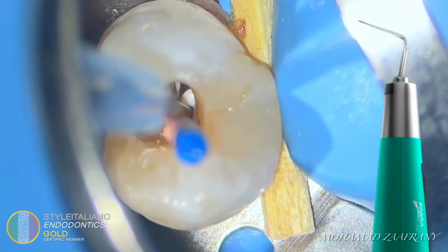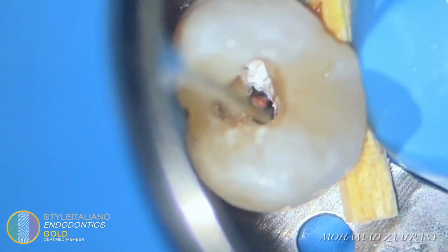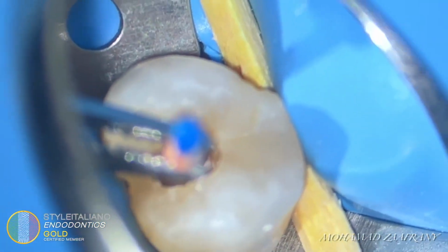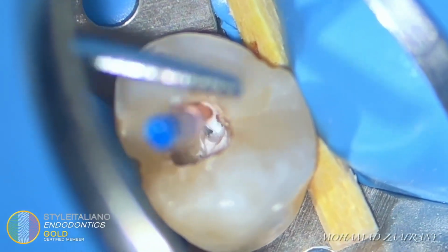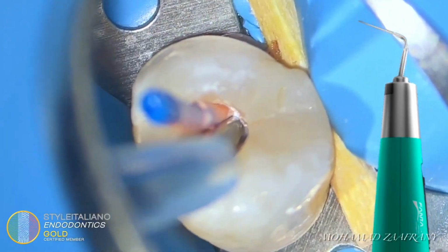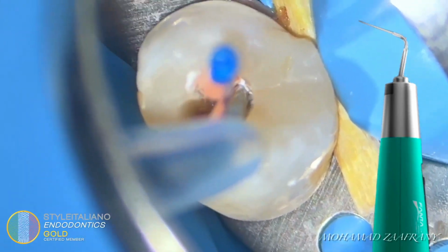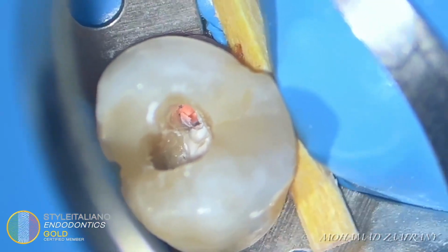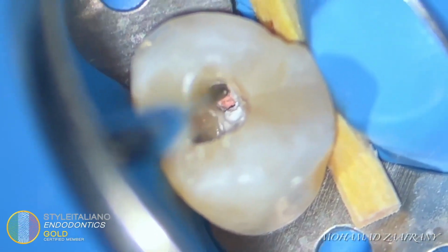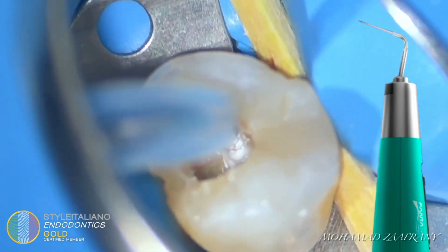In a quick stroke, I'm removing the coronal portion of the gutta-percha, then compaction using a suitable plugger. The other canal, same steps. Heat carrier, 130 degrees. Quick cutting of the coronal portion or point of resistance with the plugger. Compaction. You can do the cut 2 times, but at 130 degree temperature.